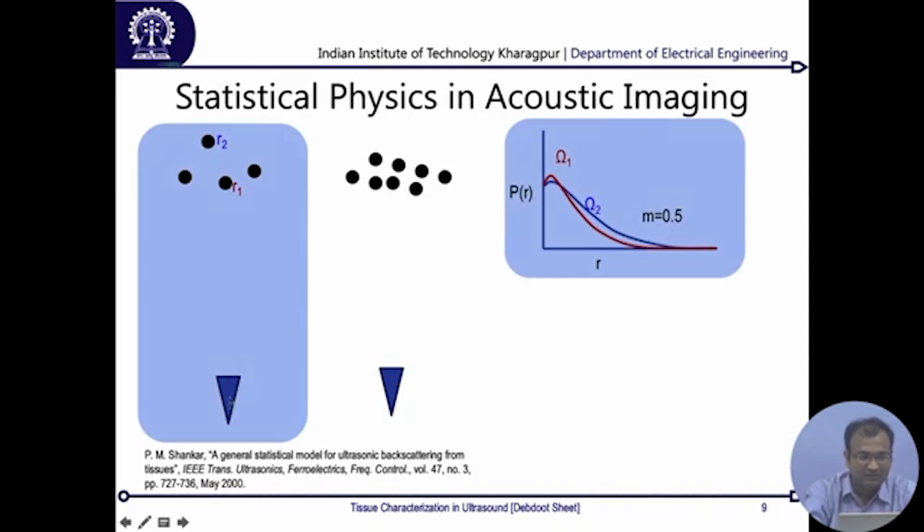Now one thing which was observed is that as you pass a pulse of ultrasound and it gets reflected back, whatever signal you are getting, you can plot as a probability function. For this example, you keep sending a pulse something like 1000 times, and for each pulse you record the intensity you have received. It is the same transducer, same tissue region, with multiple pulses, and then you plot a histogram, or find the probability density of each of these amplitudes. The amplitude of the pulse is along this x axis, called r, and on the y axis is the probability of getting that value of r.